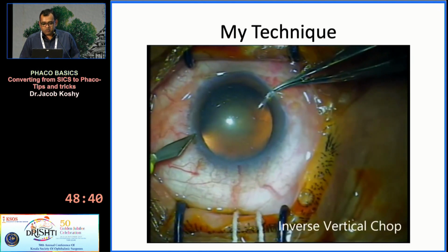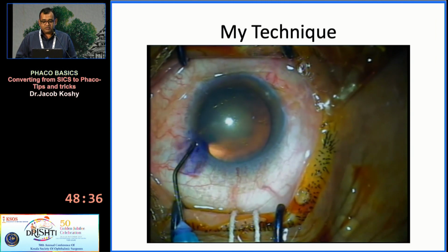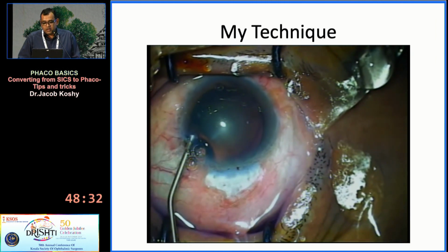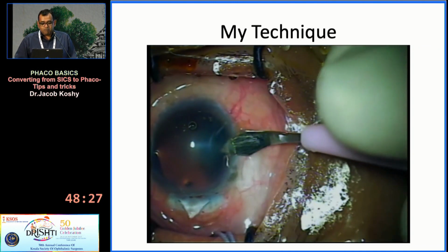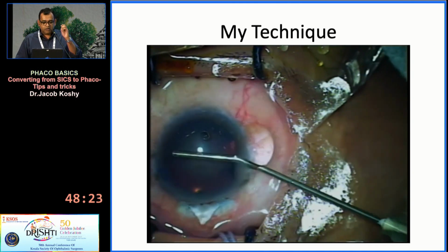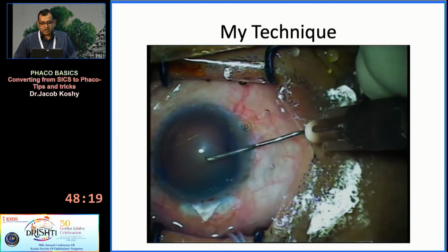I'm just going to end with one small video. For those of you who are working in settings where you don't have a senior surgeon along with you, this is how I learned 20 years ago. So I was comfortable with SICS, so I would make a temporal incision and try and do a temporal Phaco sitting at 12 o'clock. And now the reason is if I run into any trouble, I can convert to a superior SICS.